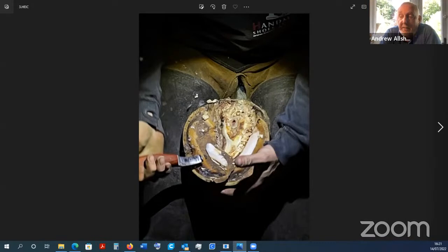So my idea, first of all, was to put this silica gel in. When it changes color, you know it's taken the moisture out. We could make a little cartridge that goes in the bottom of the foot once we've installed the plate. Then the owner can just tap the foot and see it change from orange to green, so you know when you need to change it, and that it has taken all the moisture out and helps keep the foot dry. That was one of the first ideas I had.